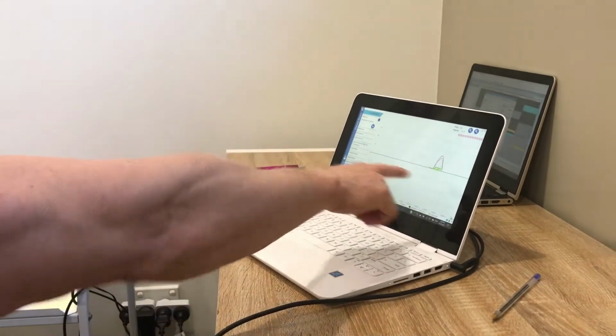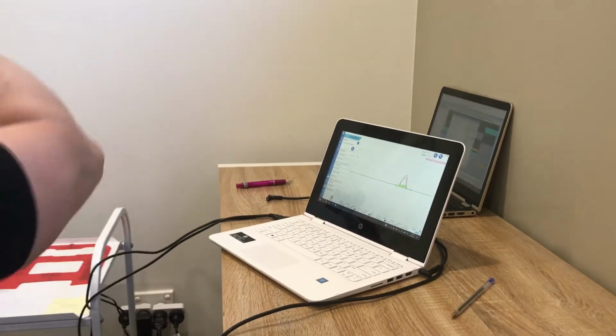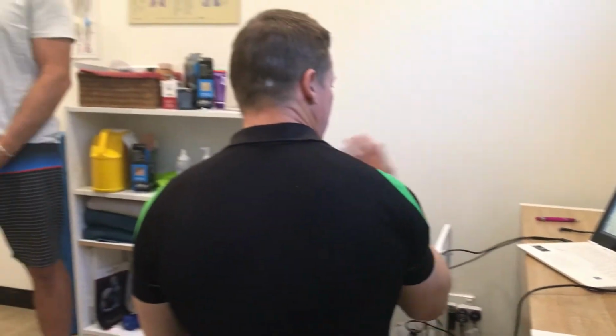The green one is your EMG, that's your muscle activity, and the other ones are the other things. And all of these things we're going to do are going to build up a picture. There's a nice report at the end of it. Nearly everything is repeated 3 times to get an average. You have to do one good one, not bad one.